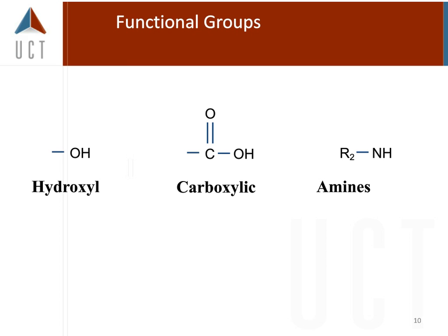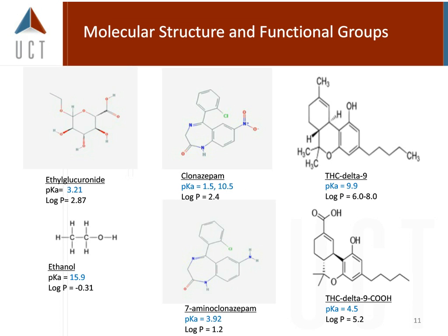With respect to what we see mostly in a lot of forensics are hydroxyls, carboxylic acids, and amines. So we're looking at the partial negative charges, partial positive charges, and then associating them with how are they going to be affected in our extraction? How are they going to be used in the solid phase extraction? And then after we collect these samples, how do they stick onto the columns? How do we see this chromatography? And which phase are we going to choose for our LC chromatography?